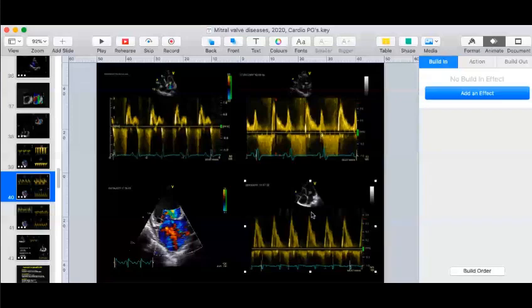The more the flow across the mitral valve, the more severe the MR. When you put a pulse Doppler, you get a very high E wave here. Generally, if it is more than 1.2 to 1.5 meters, the MR is severe. In a patient like this, with grade 1 diastolic dysfunction, this is likely to be less than severe MR. So this is the use of pulse wave Doppler in looking at the severity of MR: an E velocity of more than 1.2 meters per second indicates severe MR.